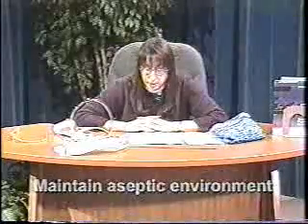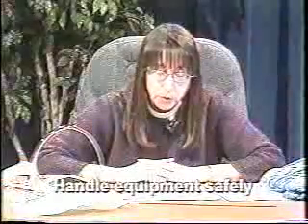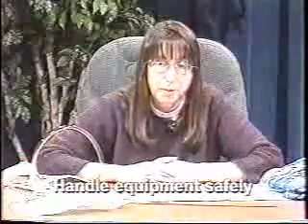Also, you must provide an aseptic environment, and it must be maintained to prevent bacterial growth and development of infections. The system must be kept closed and sterile at all times. Poor aseptic technique can cause a urinary tract infection. Catheter equipment must at all times be handled with concern for patient safety and comfort.